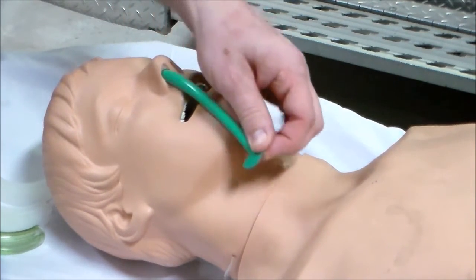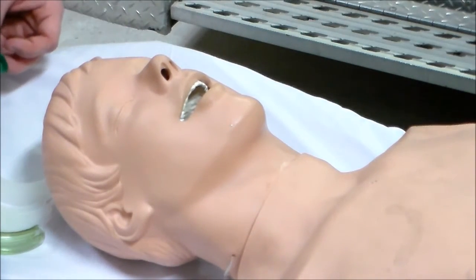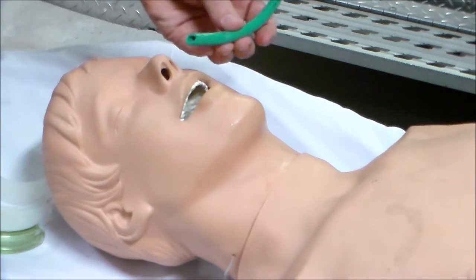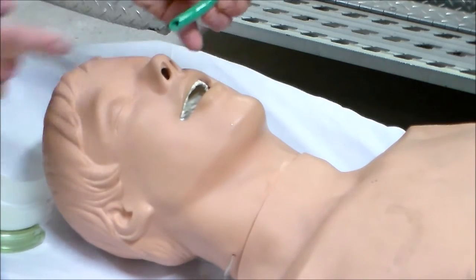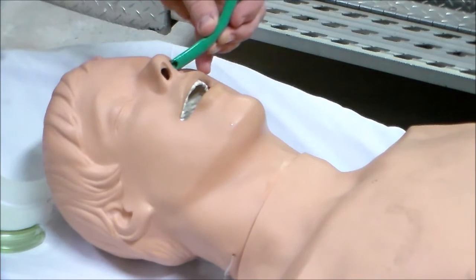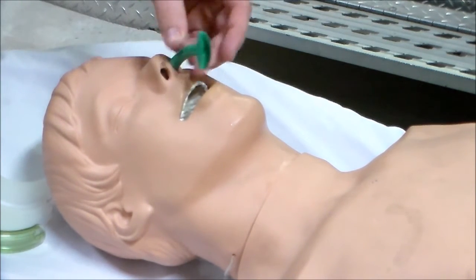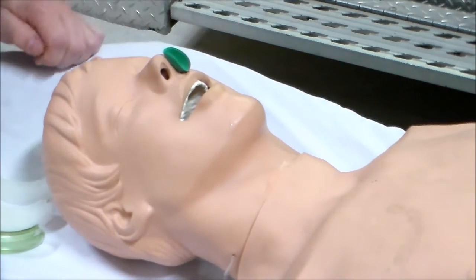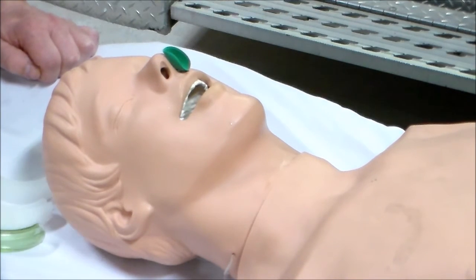Remove the airway by pulling straight out. Patients sometimes remove these themselves when they wake up. If going into the left nare, take the bevel toward the septum, insert, meet resistance, and rotate 180 degrees. The nasopharyngeal airway is now inserted into the left nare.